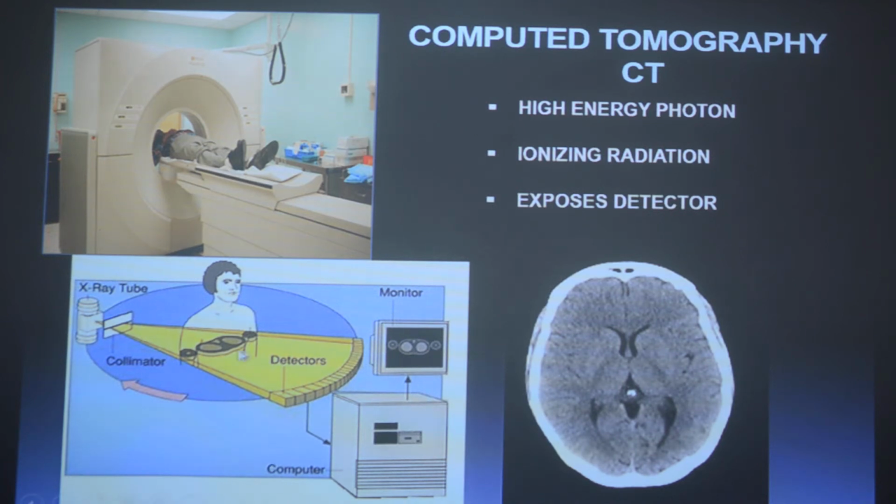Now the concept here is that the X-rays that pass through the patient, if they are allowed to pass easily, would give a different image than if they are hindered or stopped in between. Just imagine the brain tissue is soft tissue, so the X-rays would pass easily through it. Whereas the skull, which is bone, is compact tissue. The atoms are tightly bound, so the X-rays would not easily pass through the skull bone.